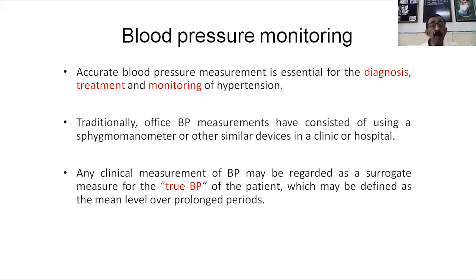Now, routinely what is done is in-office BP measurement, that is in the physician's chamber, in the clinic, the measurement of blood pressure. But the important question here is, is it a true BP? Is this recording a true blood pressure reading? What is a true blood pressure? It is defined as the mean level of various readings over a prolonged period. So what we have to focus on is the true BP monitoring rather than a single in-office chamber measurement. Why? Because we have to focus on the true blood pressure.